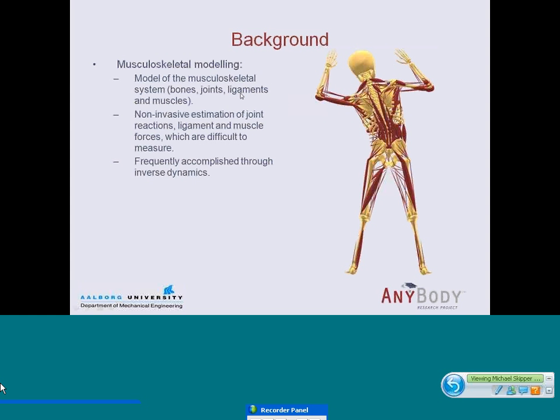And then what we're interested in doing is, from some motion or some scenario we want to analyze, we want to compute the internal forces. So the reaction forces within the joints, ligament forces, muscle forces, which are very difficult to measure in vivo. And a method for doing this is frequently inverse dynamic analysis, but there are other methods for doing this too, but I'll focus on inverse dynamics.